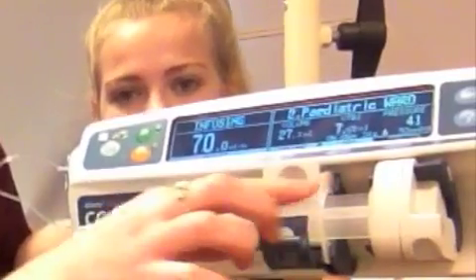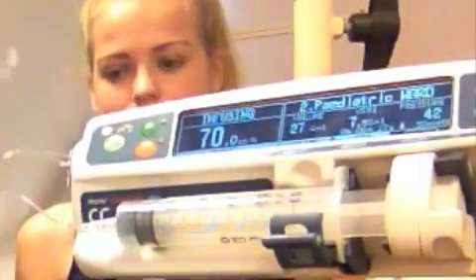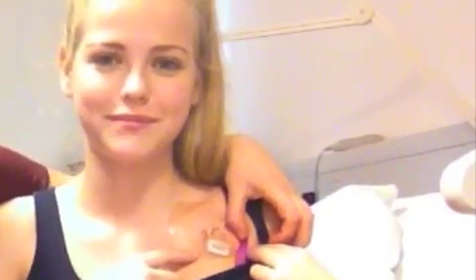As you can see, we have this next to Bethan. Alright, here's our meds. All our medicines, antibiotics, go in here, and then it goes through this little tube. It goes all the way through up here, and then it goes into her port, which is right there, and that's how she gets all her medicine.